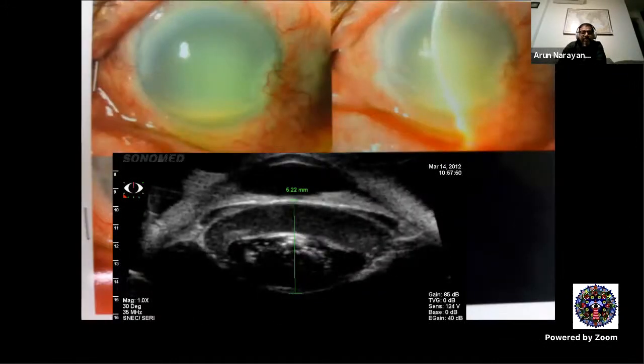Now again, you have a straightforward diagnosis of phacolytic glaucoma here, but the additional information you gain from the UBM is whether the zonules are intact or not. This will help you plan surgery, discuss prognosis, and probably have a better visual outcome for the patient when the surgery is better planned.